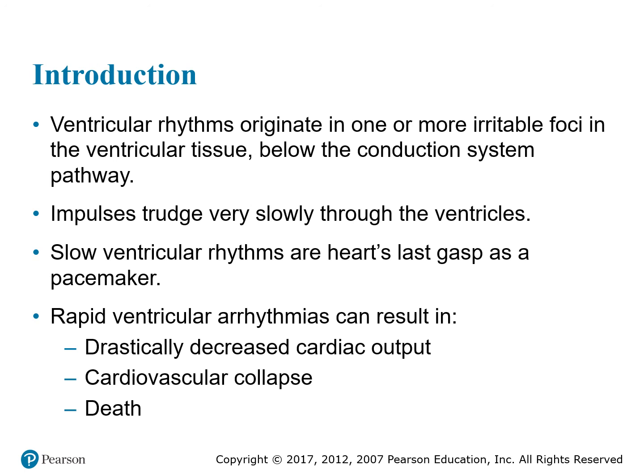The result is changes in the ST segment and T wave. The T wave is usually in a direction opposite that of the QRS. Let me repeat that: the T wave is usually in the direction opposite that of the QRS complex. If the major QRS deflection is negative, the ST segment is usually elevated and the T wave is positive, upright. If the major QRS deflection is positive, the ST segment is usually depressed and the T wave is usually negative, inverted.